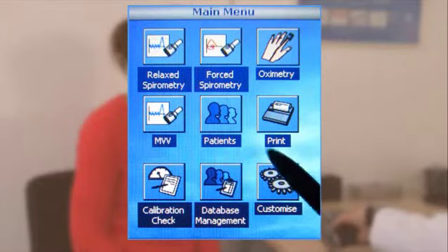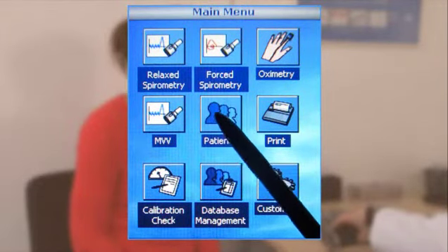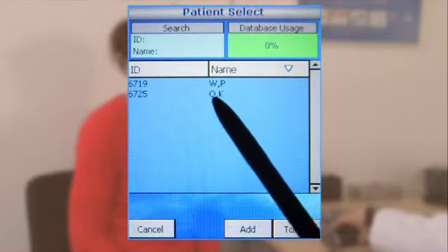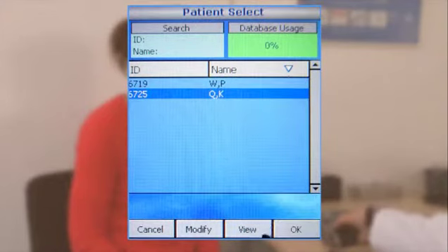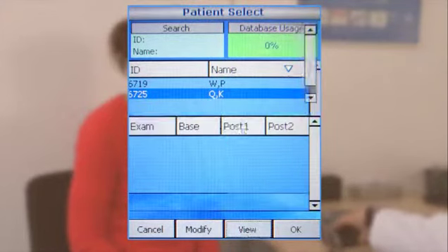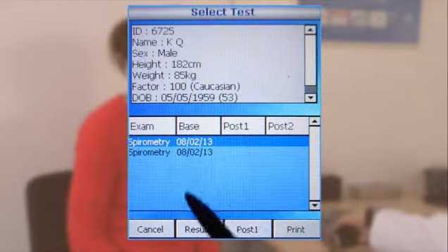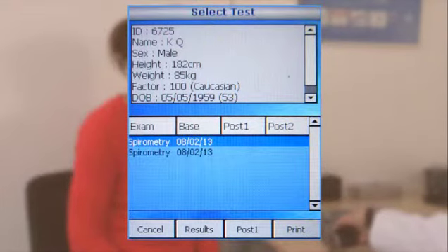To start a post-test, select the patient's icon from the main menu, then select or search for your patient and click View. Patient details will then appear in the upper section of the screen, and the date when each examination and base or post-test was performed will appear in the lower section.